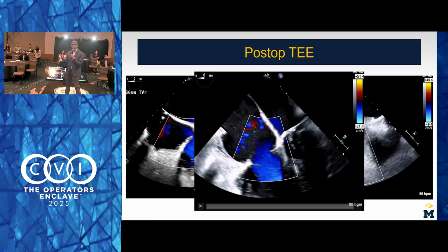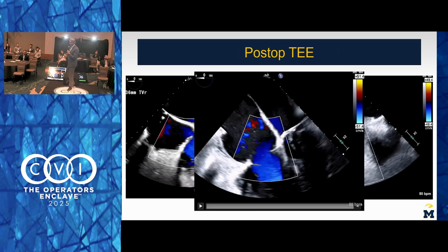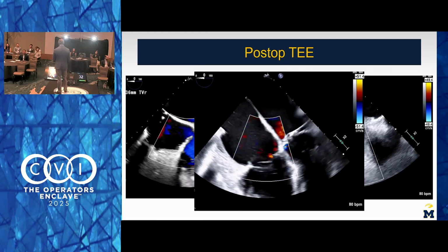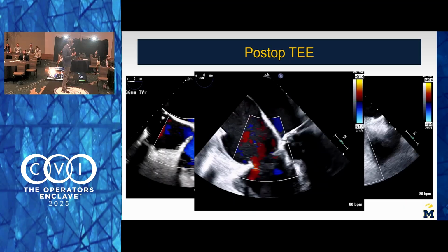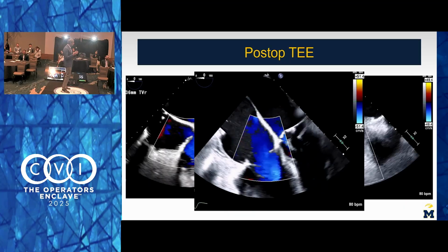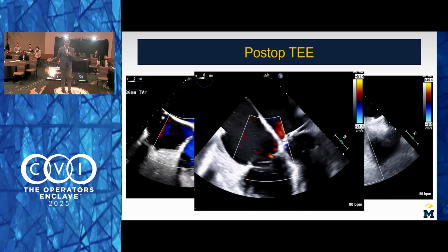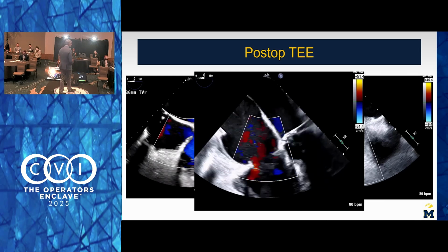And some of the other benefits that I think about, I know I've talked about this with a number of people on our panel. When we think about the difference between a repair and a replacement from surgery, what do we do differently with repair? We downsize the annulus, whereas with replacements surgically, we probably go closer to true size. Of course, with transcatheter approaches, we upsize, right? So what does that do to the base of the ventricle? I worry about that a lot.